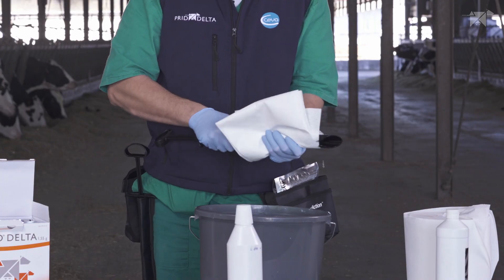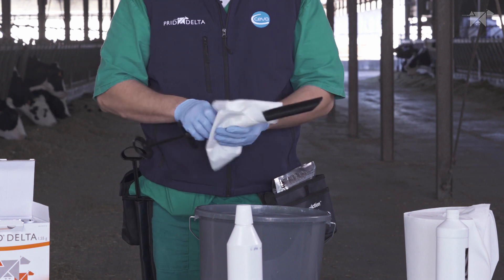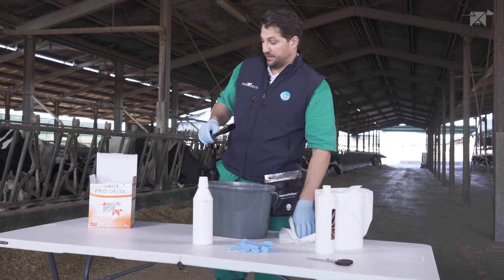It is very important to wipe dry the applicator in order for the lubricant to remain on the surface of the applicator device.